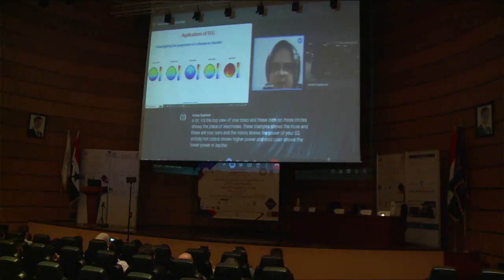And as you see, with the progression of Alzheimer's disease, the pattern of your EEG power changes significantly, and using such signs or such features, you can investigate the progression of a disease or disorder.